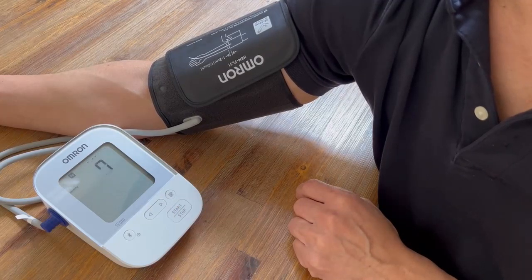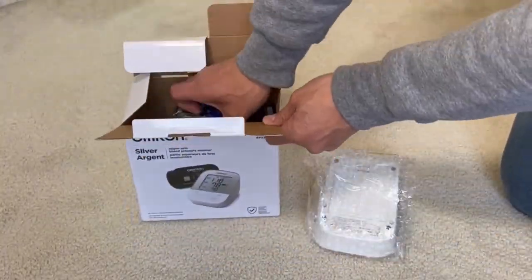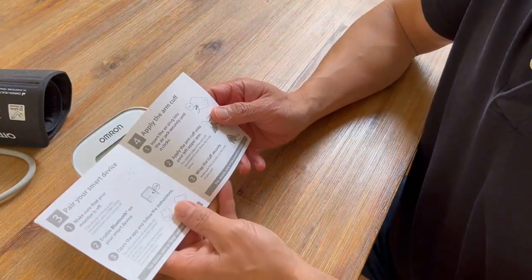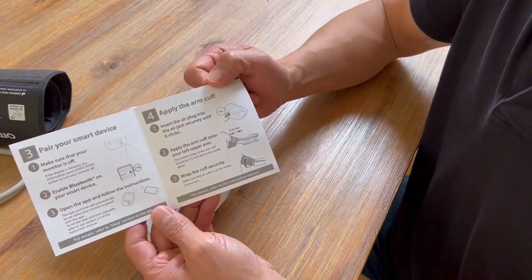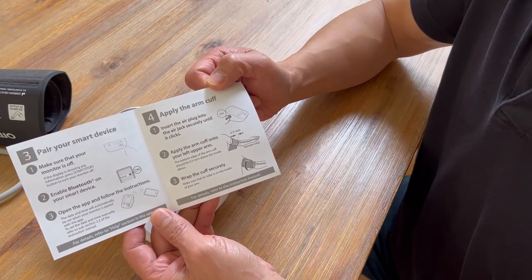Let's see how this thing looks. The unit comes with a quick start guide — it's pretty easy. Basically what you do is insert the air plug into the jack, apply the arm cuff to your arm, and wrap it securely and get it started.